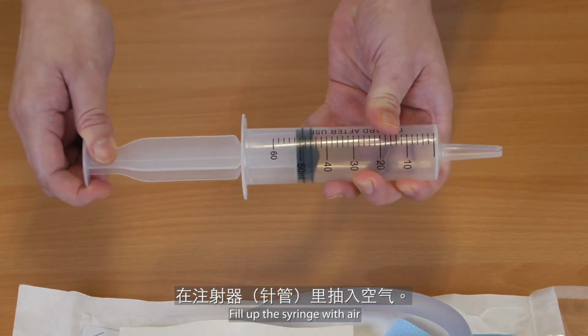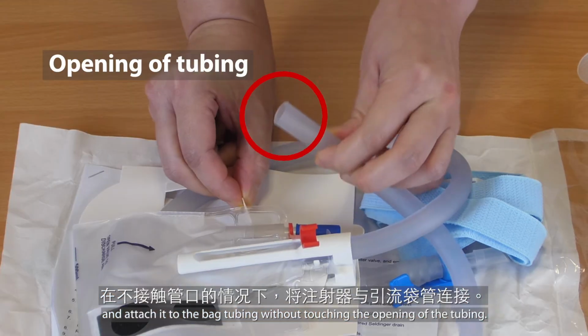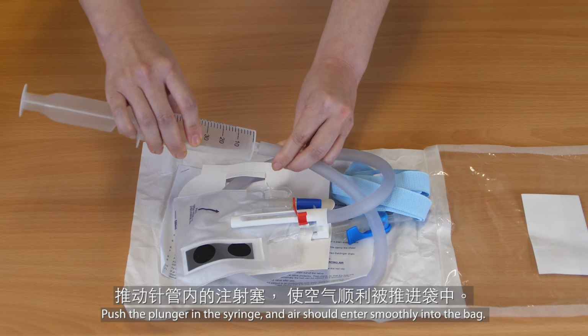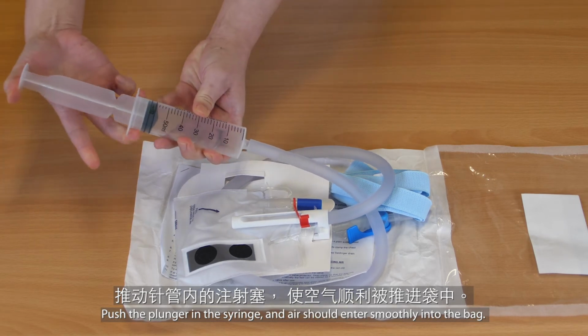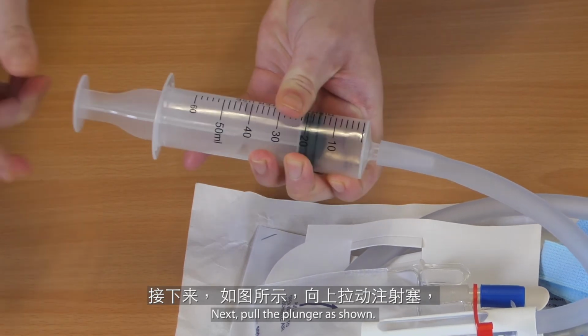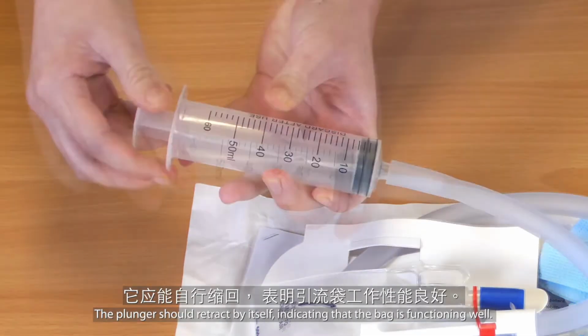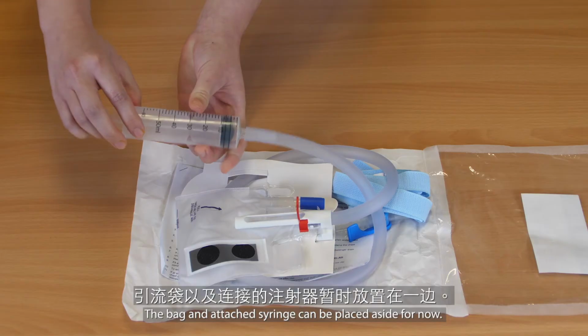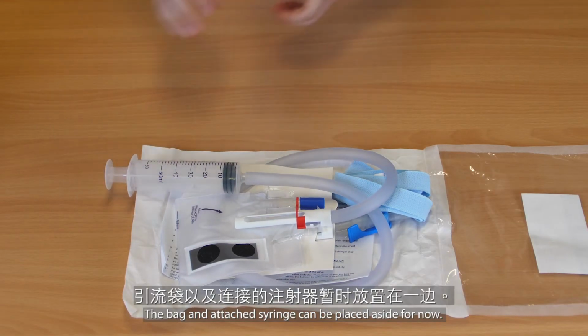Fill up the syringe with air and attach it to the bag tubing without touching the opening of the tubing. Push the plunger in the syringe and air should enter smoothly into the bag. Next, pull the plunger as shown. The plunger should retract by itself, indicating that the bag is functioning well. The bag and attached syringe can be placed aside for now.